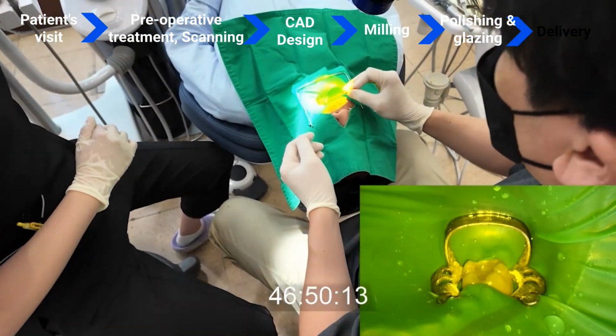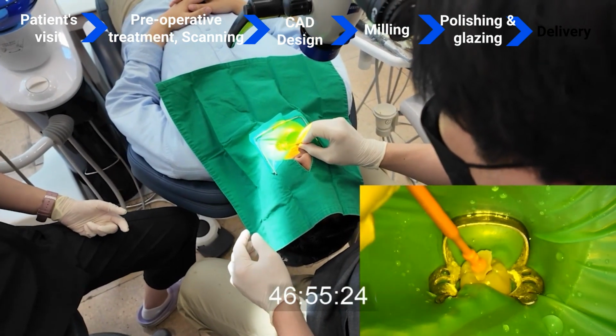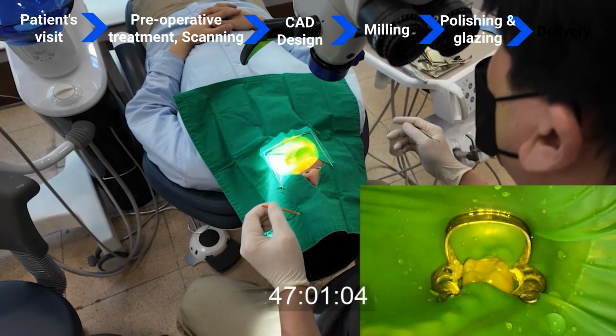After curing, we check the fit of the inlay and, if all is good, cement it into place, removing any excess adhesive.